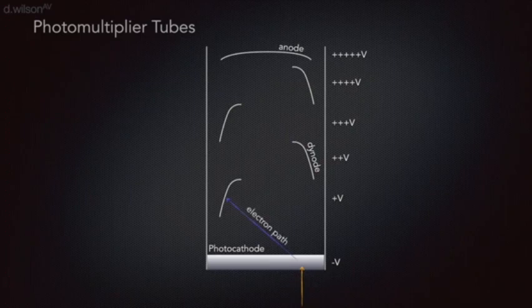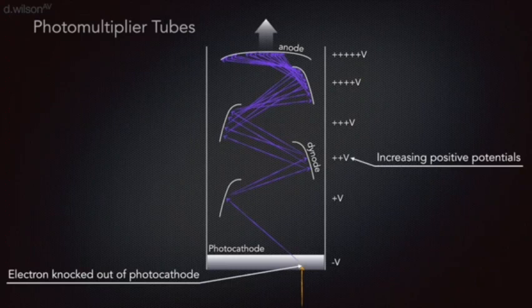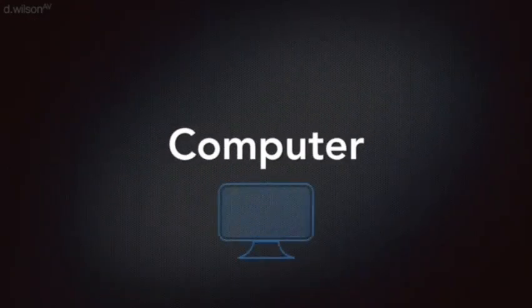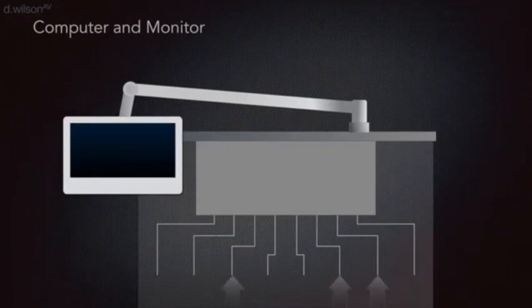They are detected by a positioning and summing circuit, which decodes the body position of the original photon. A pulse height analyzer or PHA decodes the energy of the emitted photon. And then, the information is passed on to a digital circuit on a computer where algorithms are used to reconstruct the image. The resultant image gives the physiological state of the organ.